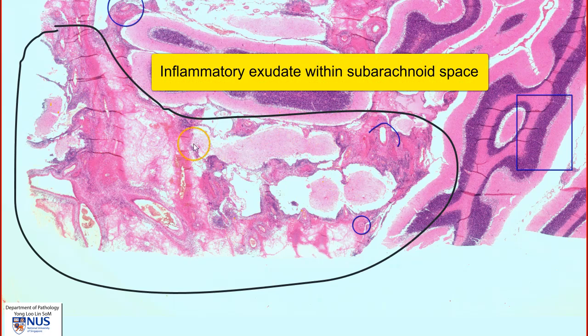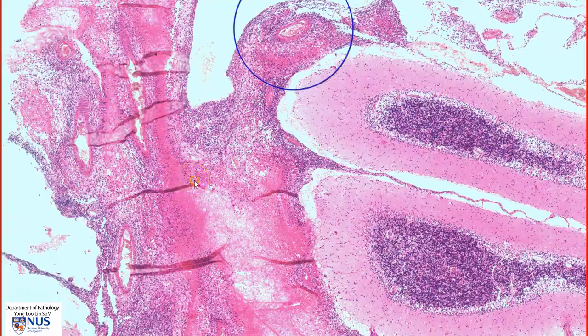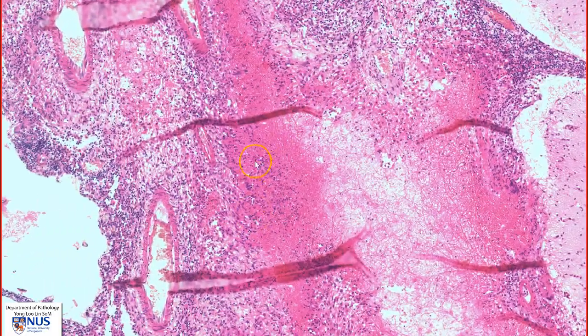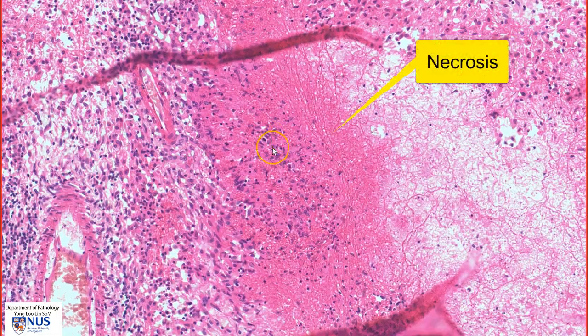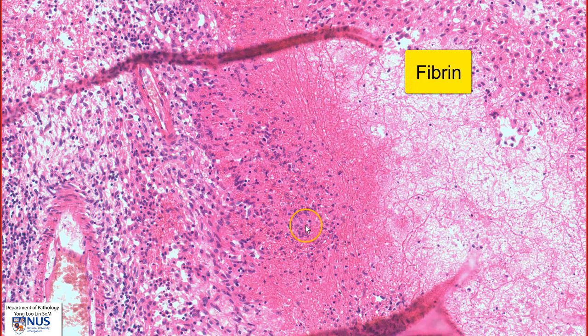This is the expanded subarachnoid space. If we look in this region, we can see that there is a lot of amorphous eosinophilic areas, which are areas of necrosis. We can also see this eosinophilic fibrillary material, which is fibrin. Hence, the exudate is usually whitish or grayish in color.